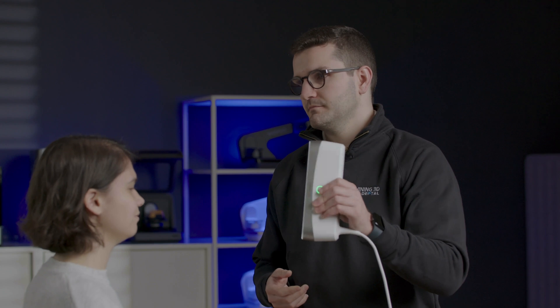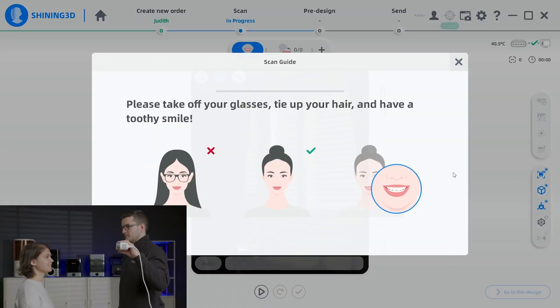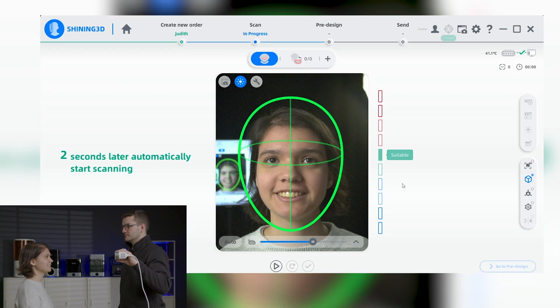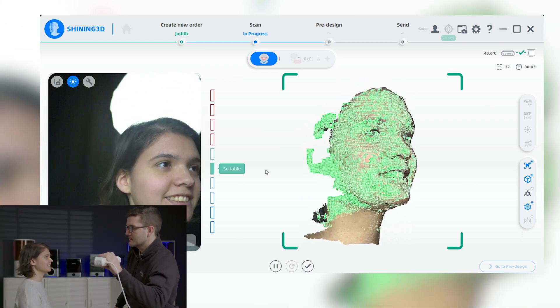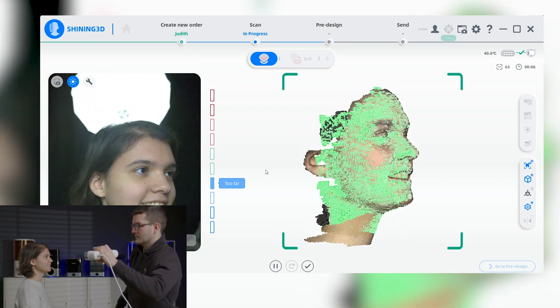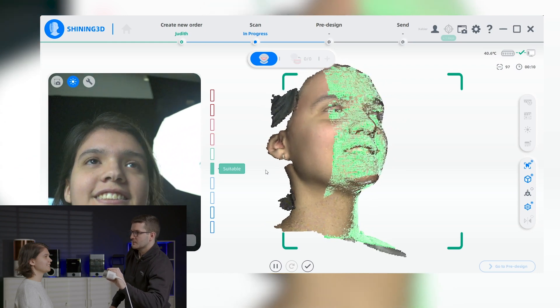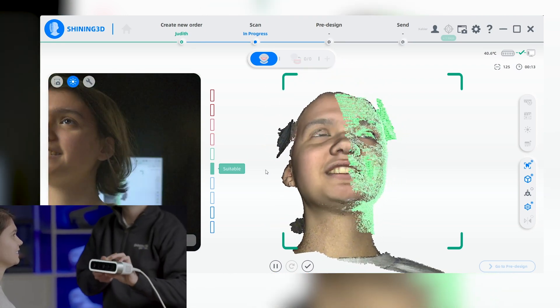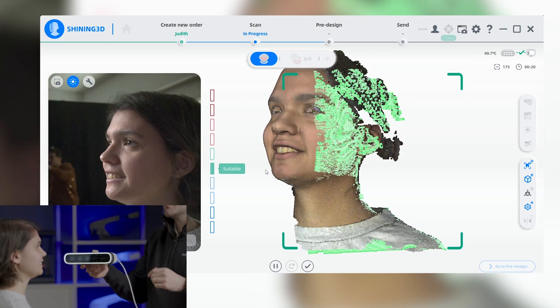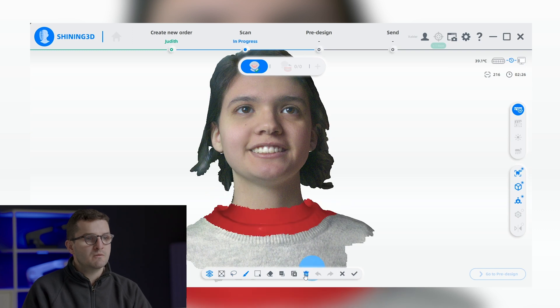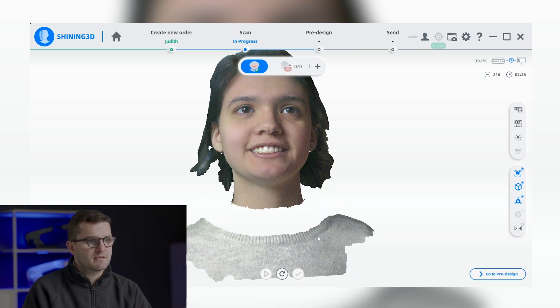Now, let's see how the scanner performs in a real scenario. After obtaining the face scan, we can further enhance the results by using our editing tools. This includes removing any unwanted scan parts and adjusting the brightness for optimal visualization.